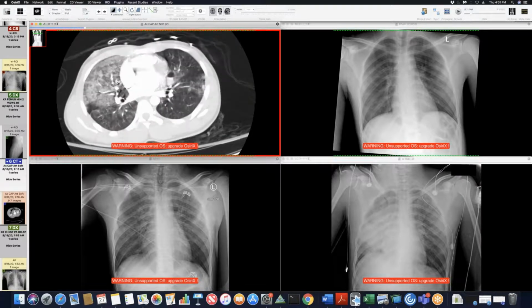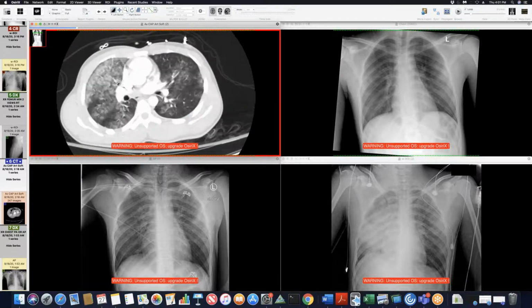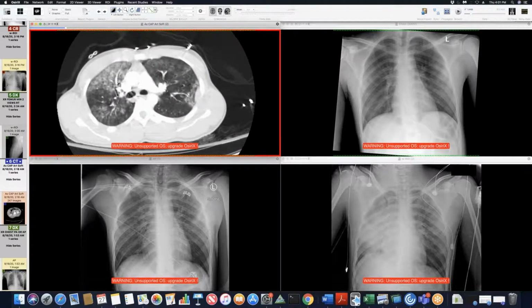But I think the other thing that's going on here, we don't know what position this guy was in when he had his motor vehicle crash. Maybe he was prone for a while, or sitting and slumped over to one side, and his blood circulation was going to carry any fat globules to that side selectively. We also don't know how long it was since he had his trauma before you got the first radiograph. It could have been several hours. Exactly, that's a good point. We don't actually know. The notes weren't very good, so I'm not sure how long it was before he actually got brought into the hospital and when this radiograph was taken.